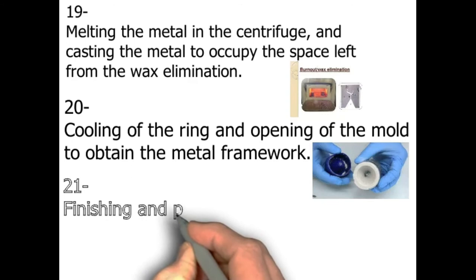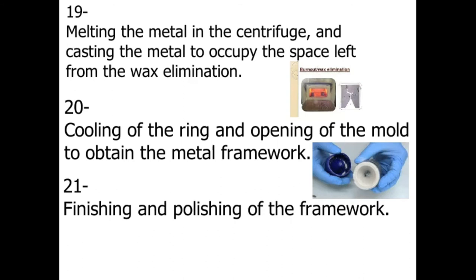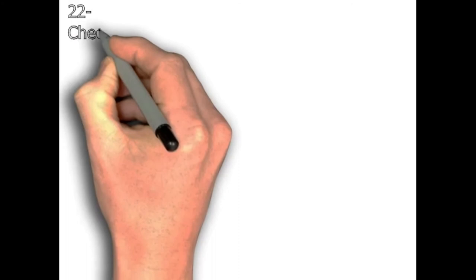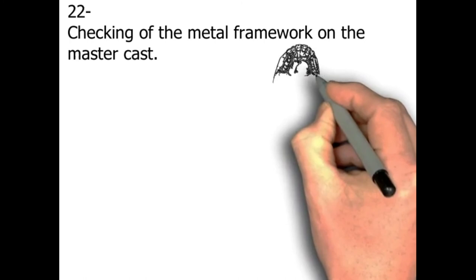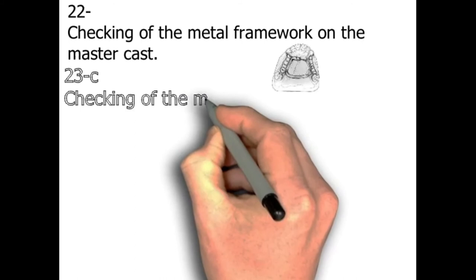Step number twenty-one: finishing and polishing of the framework — that's a laboratory step, and the picture shows the finishing and polishing of the framework. Step number twenty-two: checking of the metal framework on the master cast — that's a laboratory step, and the picture shows the master cast and metal framework.